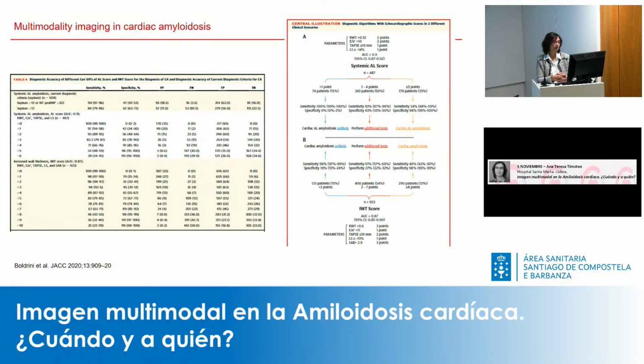As an alternative, several scores have been developed to overcome this problem and to increase the predictive accuracy of echocardiography.